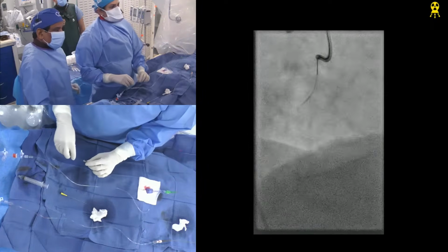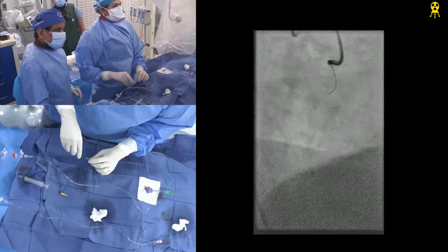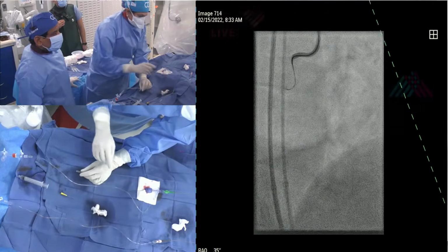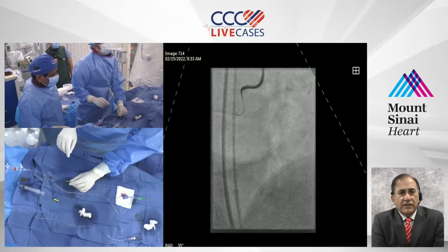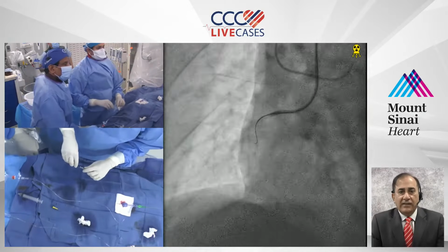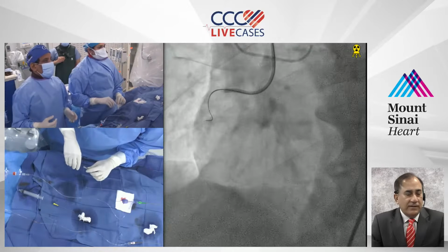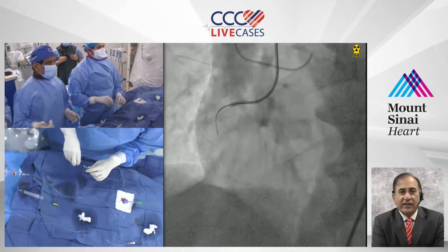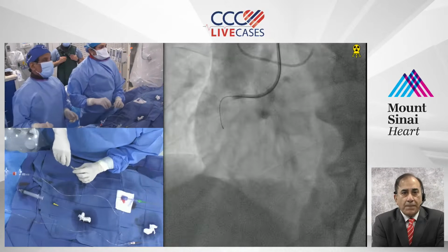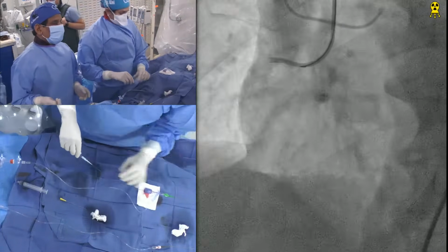I think we make an additional curve on this one. I want to go with the, and go to back alley. Yeah. So just speculating, the difference between Fine Cross and the Corsair exactly in this moment as you're doing it? Do you think Fine Cross? I may want to go back to Fine Cross. Yeah, I had a feeling because the Corsair kept directing the wire more towards the RV branches. Right. Yeah. So the biggest thing, Corsair is 1.3 French compared to 1.8 of the Fine Cross.